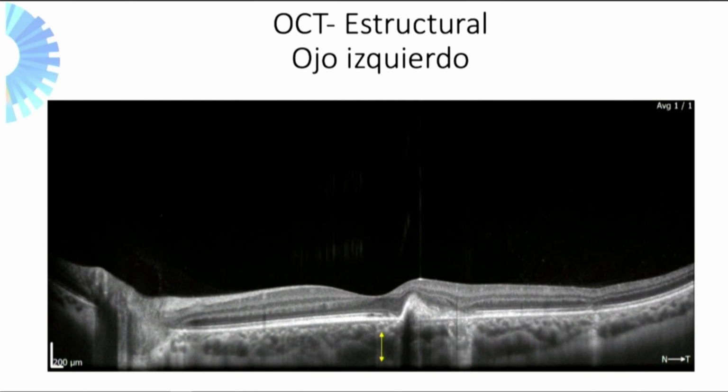This is fibrinoid tissue. Just take a look at how we see major atrophy of external layers in connection to these wedge images. Many times, this might simulate intraretinal fluid. These images start from the external plexiform layer and make a deep dive to the external layers of the retina. This is apoptosis from the external plexiform layer down to the photoreceptors and the RPE. If we follow this patient over time, this wedge will reach from here to there.